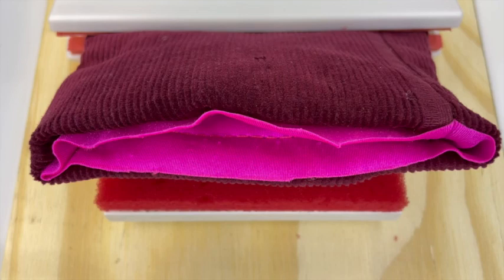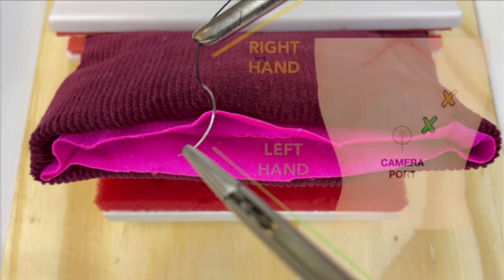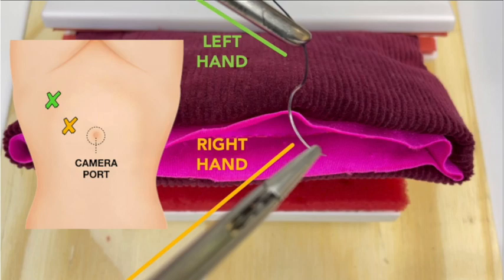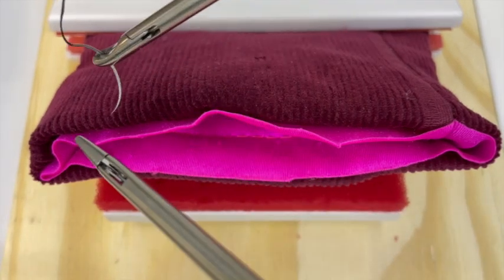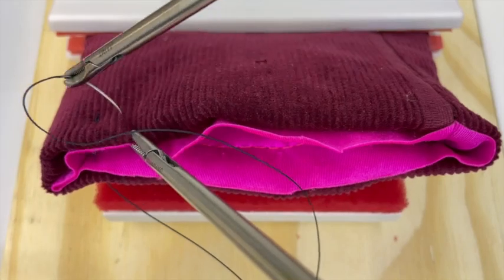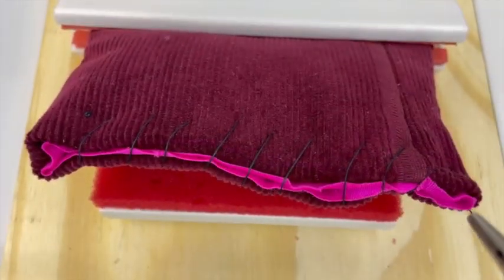The ipsilateral port configuration demonstrated here involves standing on the right side. The right hand is located in a right lower quadrant port and the left hand in a right upper quadrant port. The surgeon may prefer to stand on the patient's left side depending on hand dominance and comfort. For optimal ergonomics, begin at the left apex and suture anterior to posterior sequentially towards the right apex. Adjusting the table height and/or using steps can enhance positioning for comfort in the shoulders, elbows, and wrists.